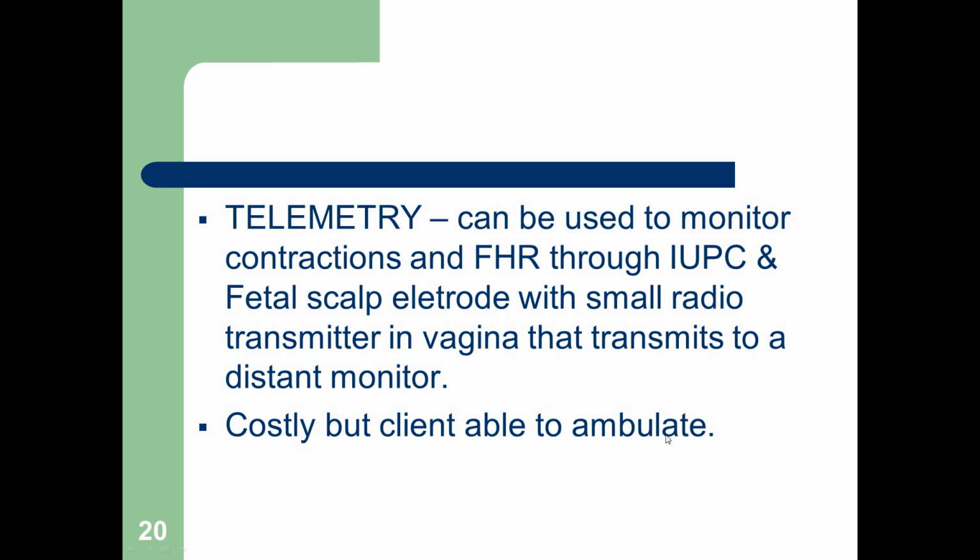Telemetry can be used to monitor contractions and fetal heart rate through an IUPC and fetal scalp electrode with a small radio transmitter in the vagina that transmits to a distant monitor. It's costly, but the client is able to ambulate. So we don't typically see this, and I've never seen someone in labor monitored like this. However, I think in some of the literature it states it can be, but I've not seen it here, okay?